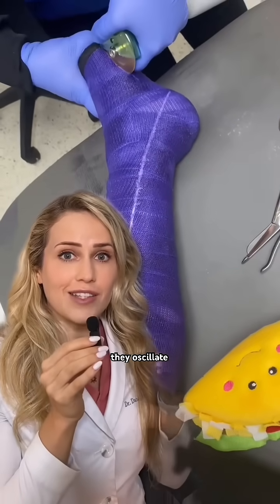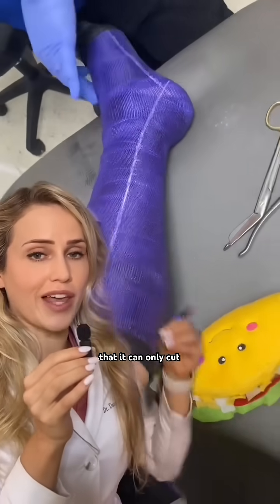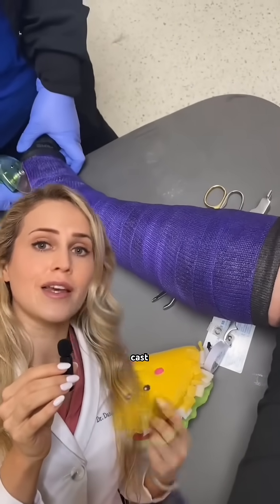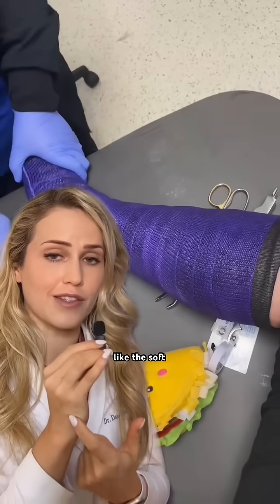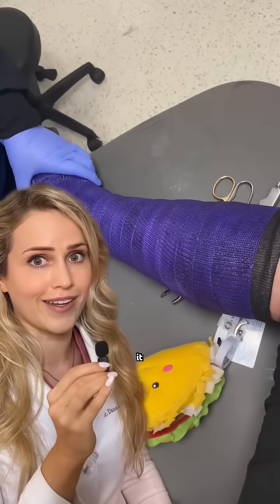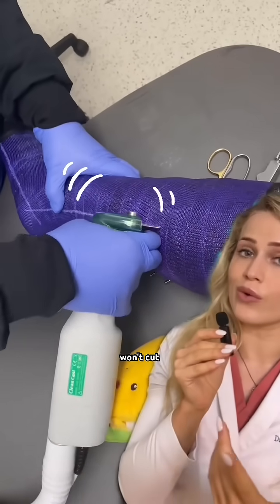How they actually work is they oscillate back and forth a very tiny amount — so much so that it can only cut through hard things like this plaster cast. But if it hits something soft like the soft tissue of your skin, it just moves it back and forth without cutting it. So it will cut through the cast right there, but it won't cut your skin.